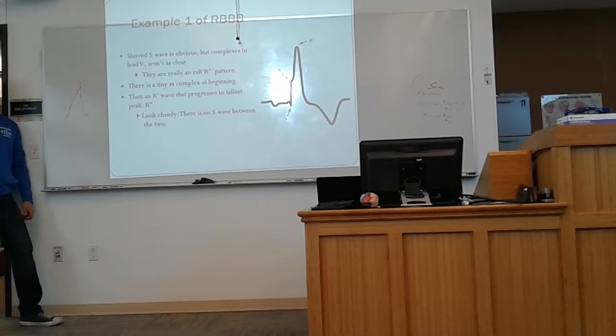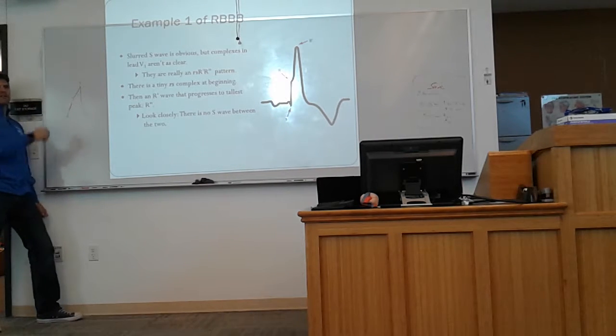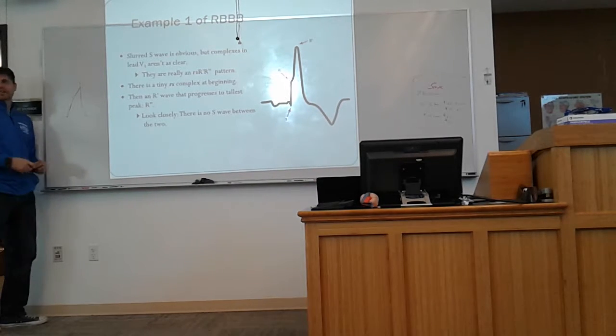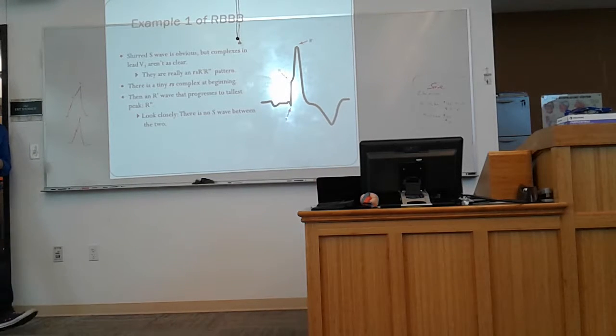You know it's not artifact because you'll see it continuously, because you'll see it in other ones as well. And I don't see any evidence of artifact anywhere else. That's right. But I'll have to look at that, right? Does that make sense? So it can be extremely subtle, or it can be very distinct. It doesn't matter whether it's subtle or distinct, right?